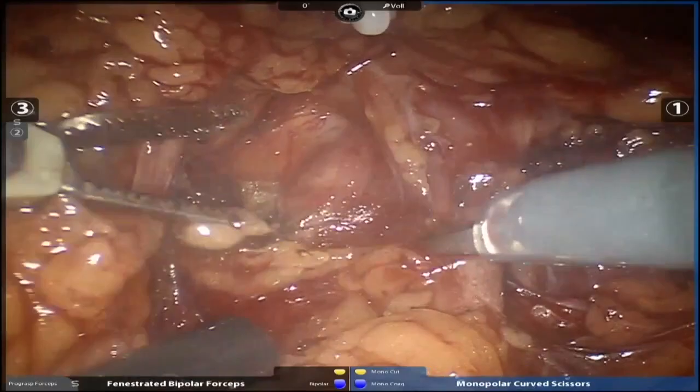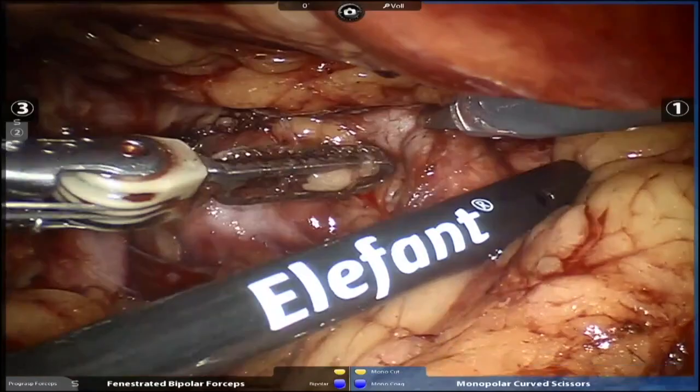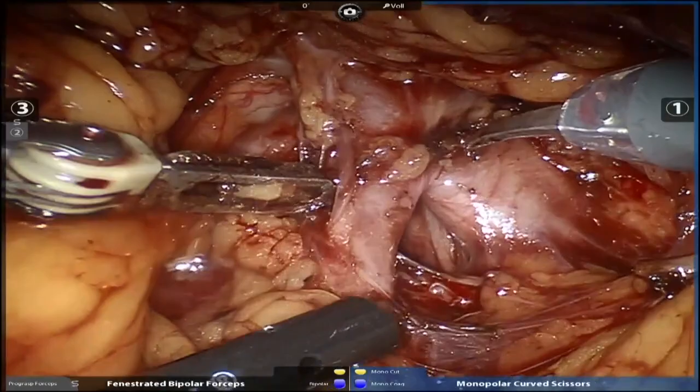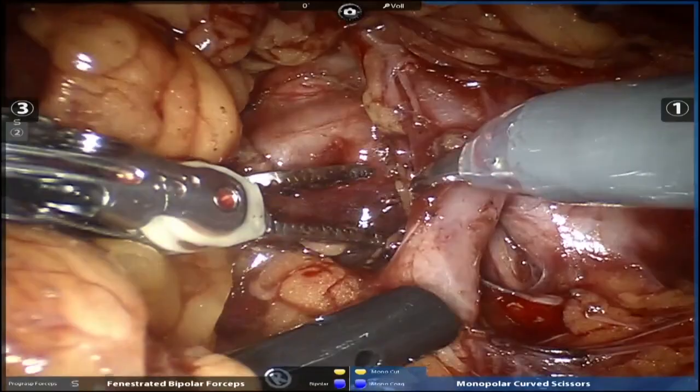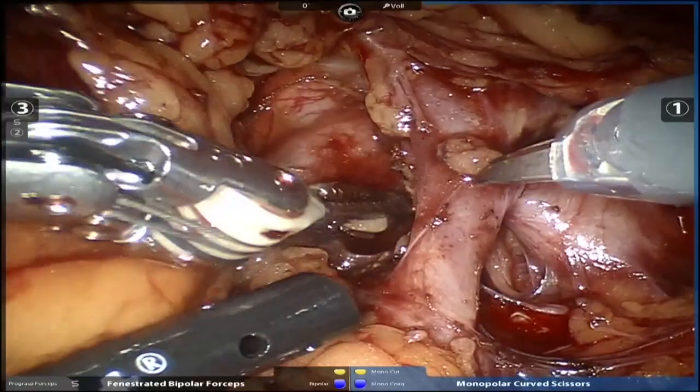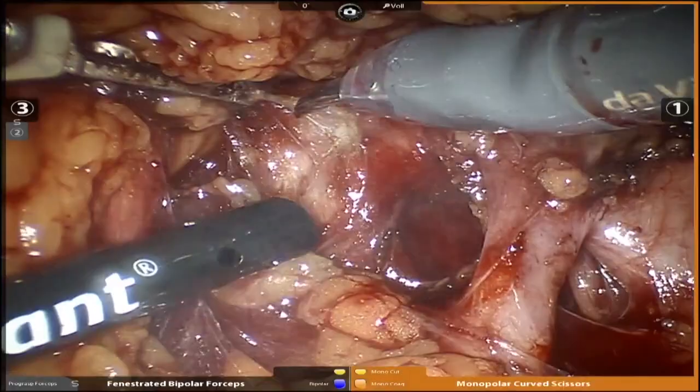So this is why I came back here, because the imaging suggested. So let's be clear. This is one artery I found, okay? That's one artery. All right? There's one giant vein. I'm probably going to take this vessel to get it out of my way. That's a lumbar. And again, this is all about the imaging. I have to say, the imaging is incredible. So we've got a vessel here. And I could have ignored it, but at my own peril, I guess, right?